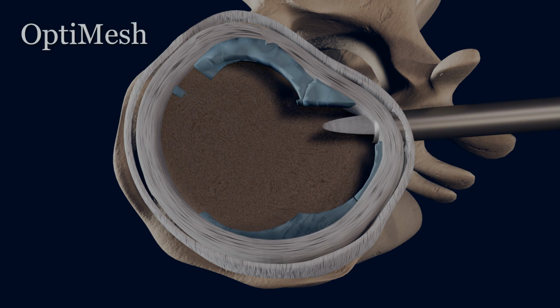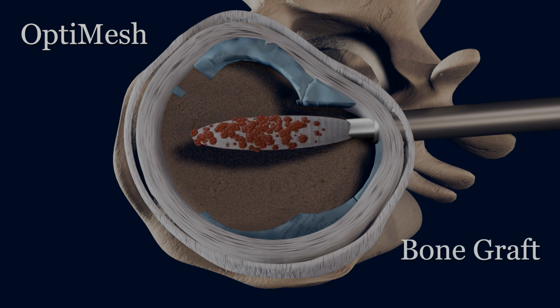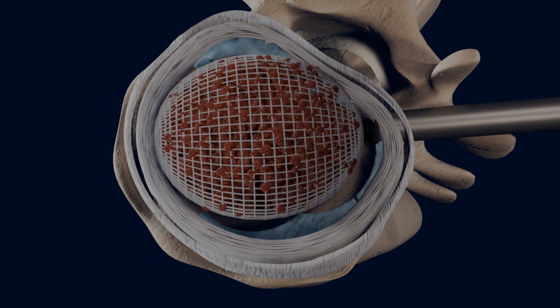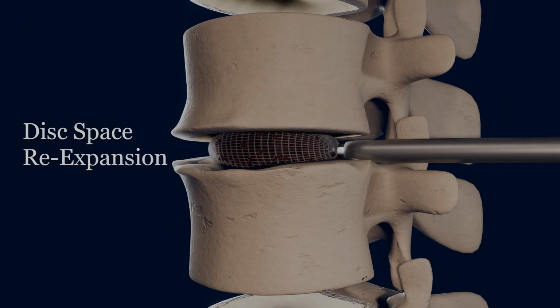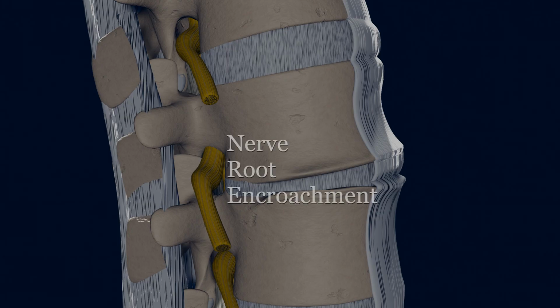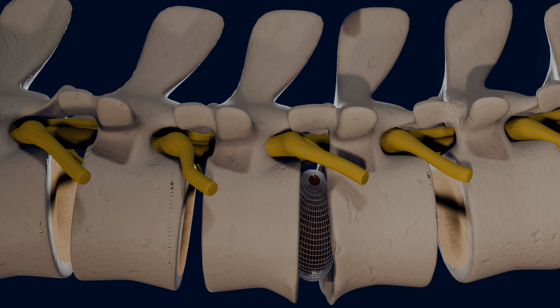A synthetic fiber mesh structure, known as an Optimesh, will be inserted into the disc space. Bone graft will be impacted into this mesh, expanding it and filling the disc space. Impaction force will re-expand the disc space. This serves to remove the nerve encroachment caused by the collapsed disc space. Metal screws and rods will be inserted to support the vertebra until the bone graft fuses with the adjacent vertebra.